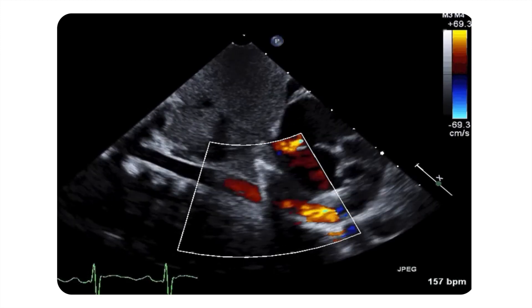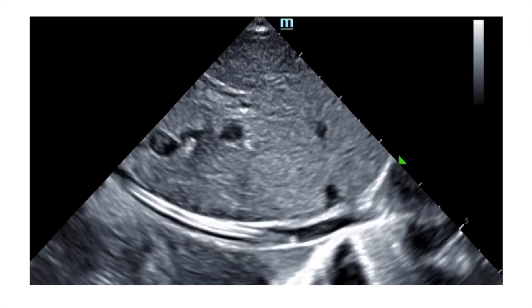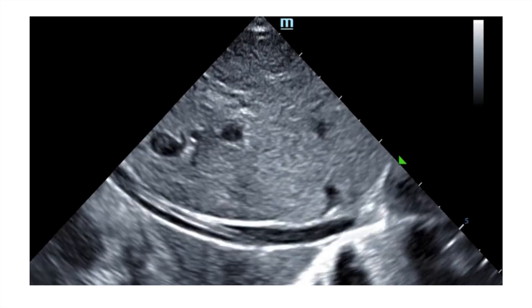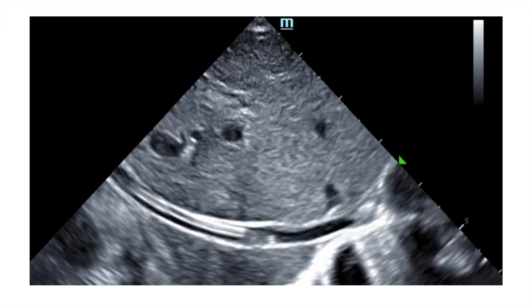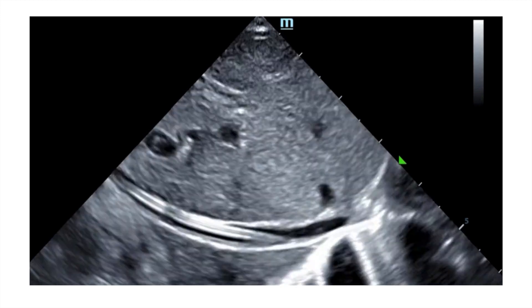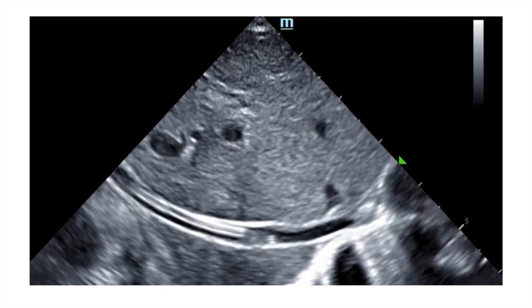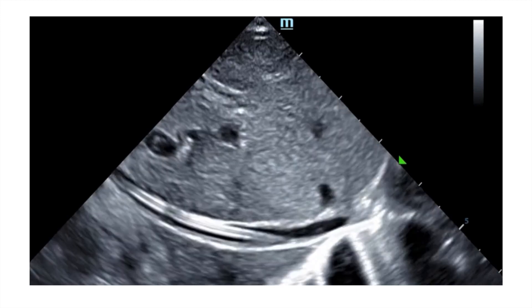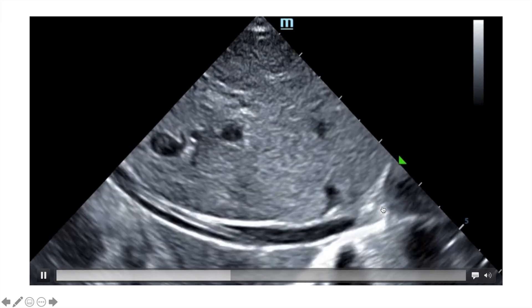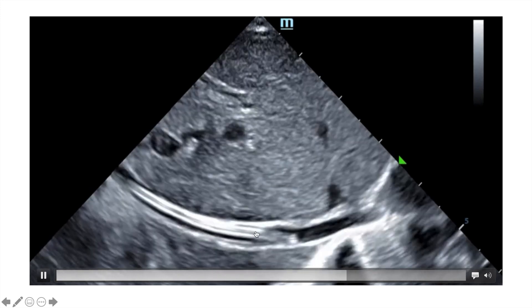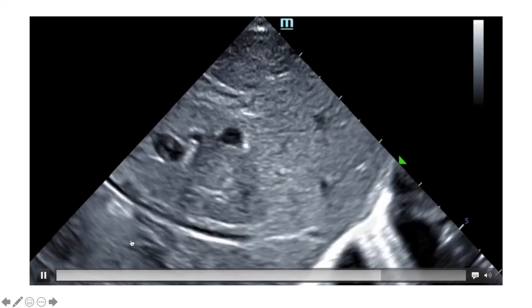For PICC lines, this is the IVC from the subcostal view. You can see the IVC with a PICC line inside — it's in a pretty good position. You don't want the tip very deep inside the right atrium; you want it at the entrance or just slightly in that area. This is a well-positioned PICC line.